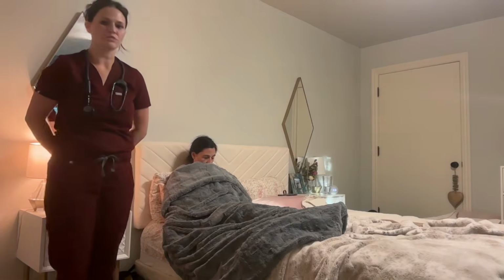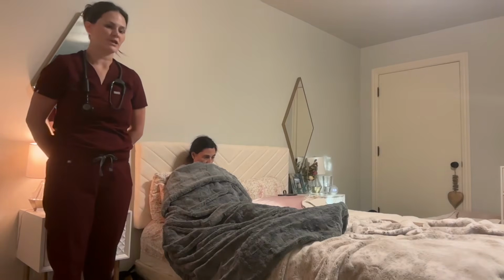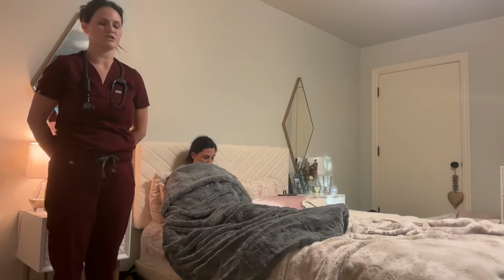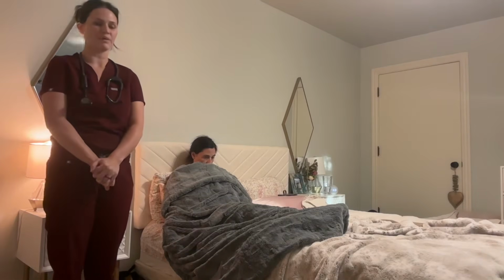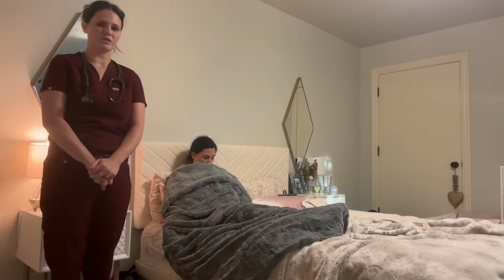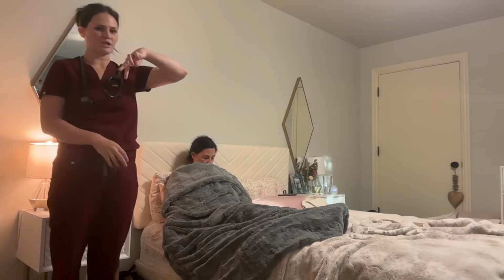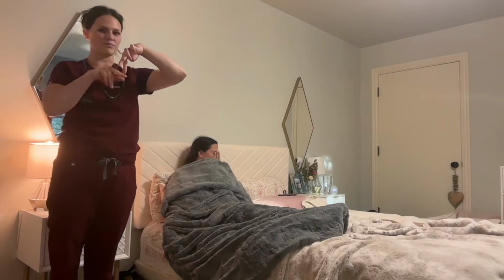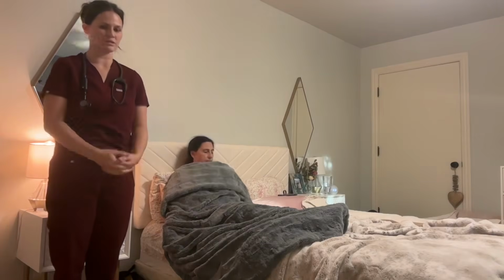Once we are completed with that process, we will assess which speculum to use on this patient, making sure we have the appropriate size. Again, going over each step with her, making sure she is comfortable with all of it, not having any abnormal amounts of pain. When inserting the speculum, we will open the patient's labia as wide as possible, inserting the speculum in a downward position and moving it horizontally, making sure that we are going nice and slow, making it, again, as comfortable as we can.